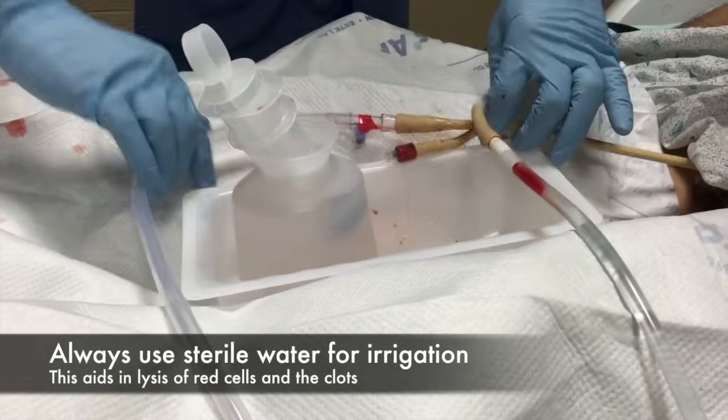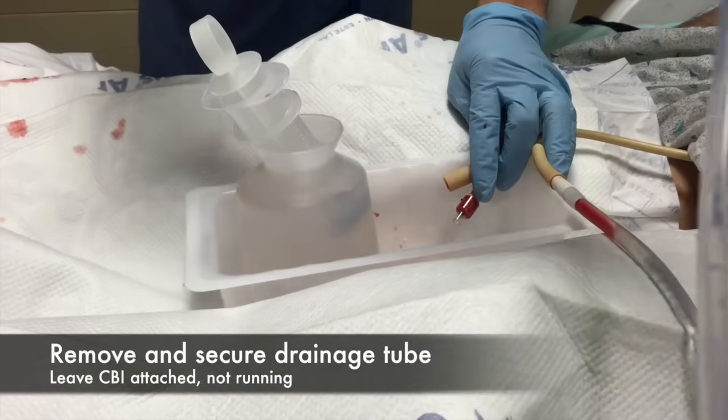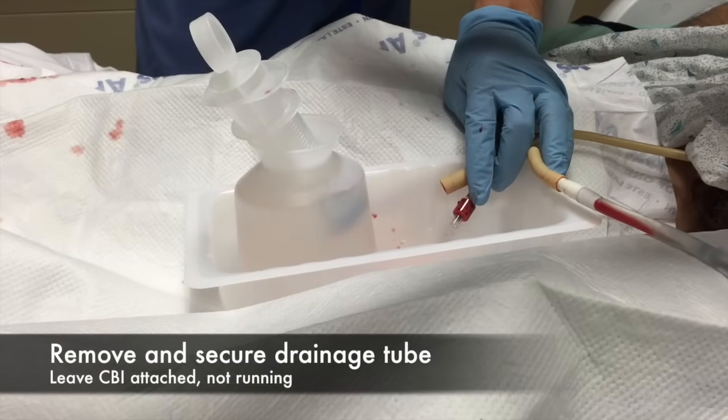As you can see, the syringe has a hole at the end, a ring for your index finger or thumb, depending whether you're doing a two-hand or one-handed technique.